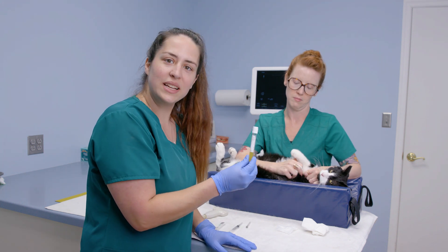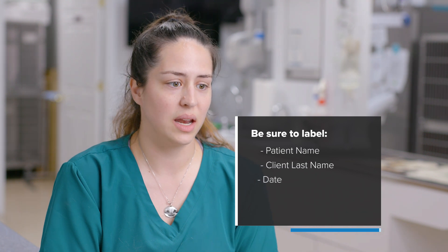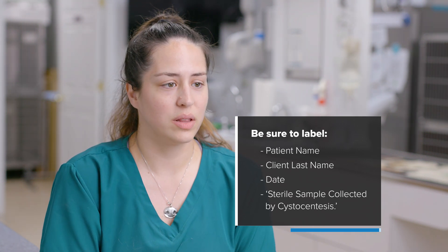Our urine sample is now ready to run in-house or send to the lab. It's important to place the sample into the urine container using sterile technique. We remove the used needle — as it may have picked up cells or debris — and place a new clean needle on the syringe to insert directly into the top of the urine tube. After collection, label the tube with the patient's first name, last name, the date, and note that it is a sterile sample collected by cystocentesis, so the lab has all the necessary information.